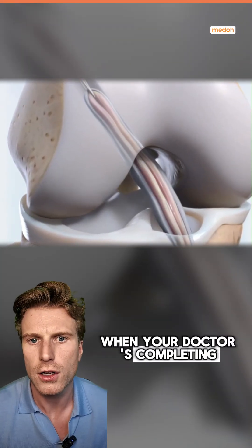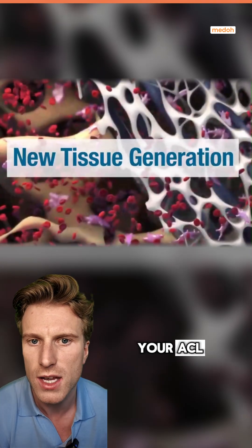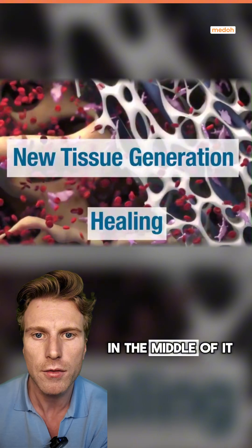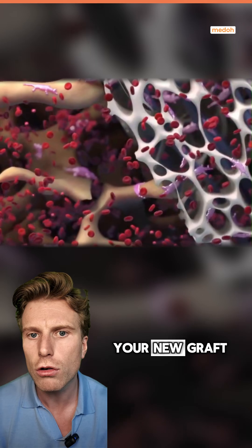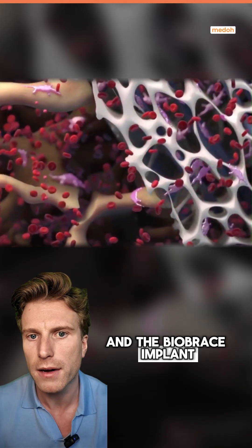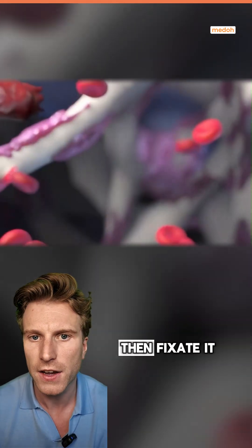Here's how it works. When your doctor is completing your ACL reconstruction, he'll prepare the graft that's going to replace your ACL and put the Biobrace in the middle of it. He'll drill small holes in the thigh bone and shin bone, then place your new graft and the Biobrace implant directly into those tunnels and fixate it.